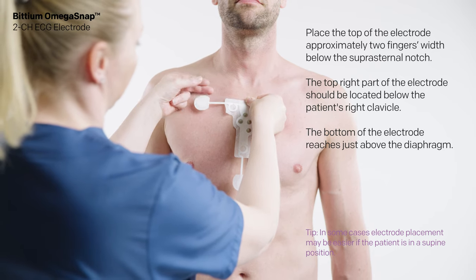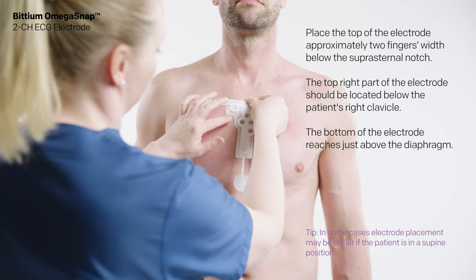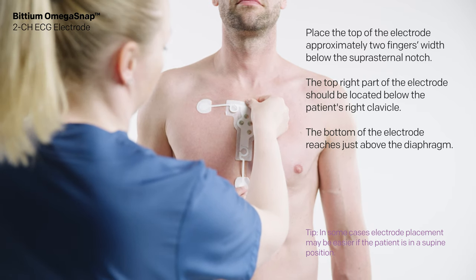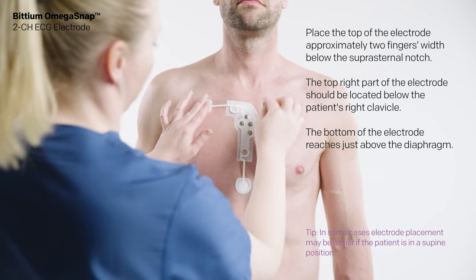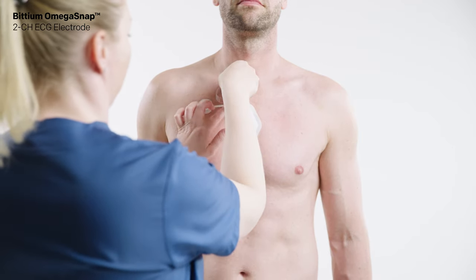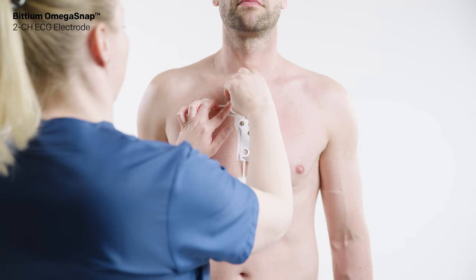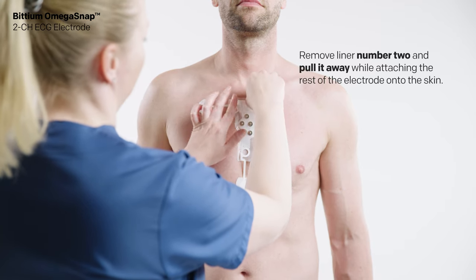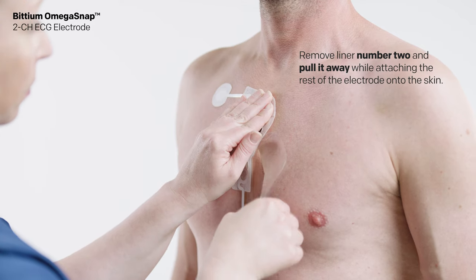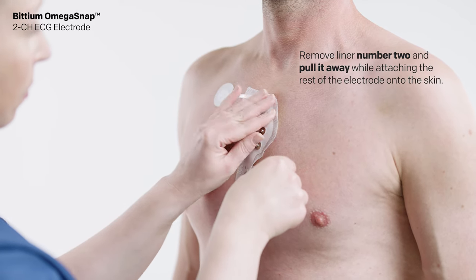Place the top of the electrode approximately two fingers' width below the suprasternal notch. The top right part of the electrode should be located below the patient's right clavicle. The bottom of the electrode reaches just above the diaphragm. When the electrode is attached and properly aligned, remove the liner marked with number two and pull it away while attaching the rest of the electrode onto the skin.